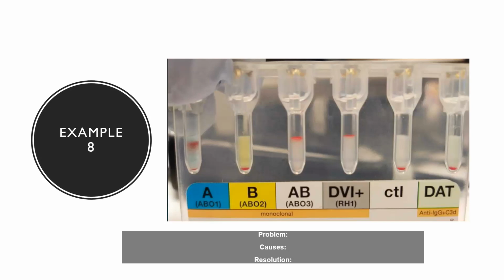And that's another thing that can be plus or minus. When you test A3 with anti-A,B, usually you get mixed field too. So that would be a good thing to look at. It would be good to think A3 if you did not see this AB.